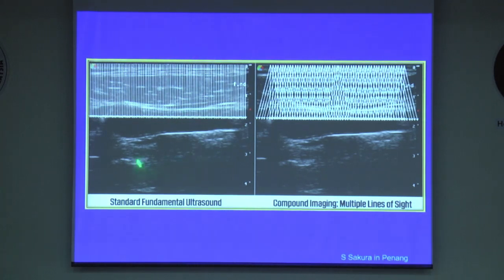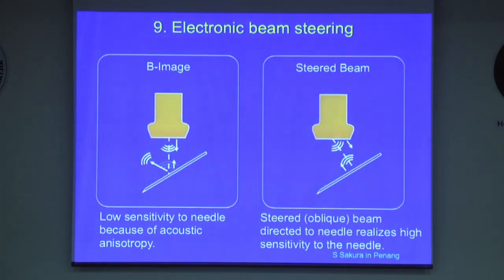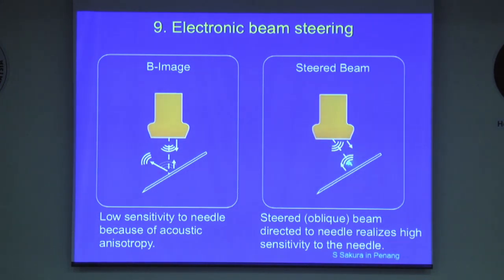The left-hand side shows an image with simple beam mode imaging, while the right-hand side shows an image with multiple lines of sight. Electronic beam steering is a very similar technology, but allows the ultrasound to be tilted relative to the transducer to increase the needle-beam angle of incidence toward 90 degrees.